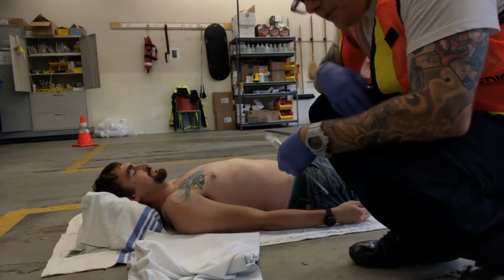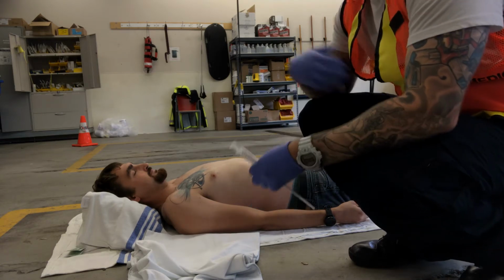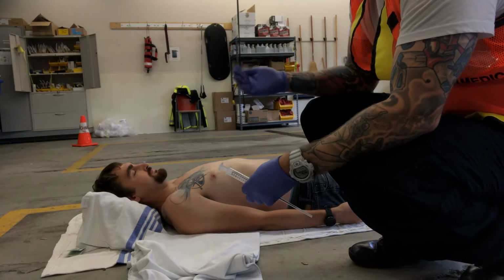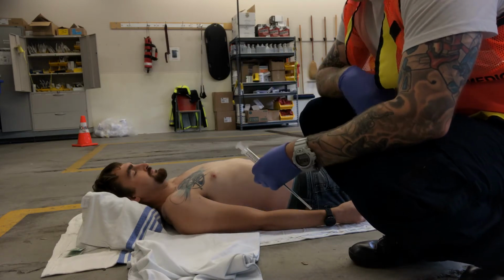Hello, my name is Graham Southwick, and this is needle decompression. When I approach the patient, I'm assessing for a potential tension pneumothorax.